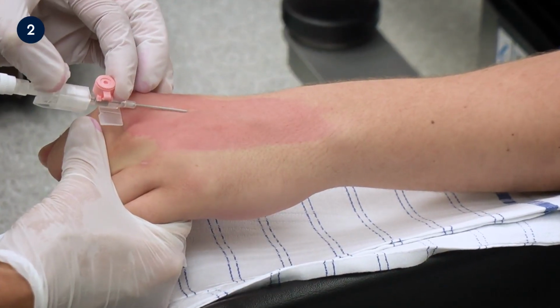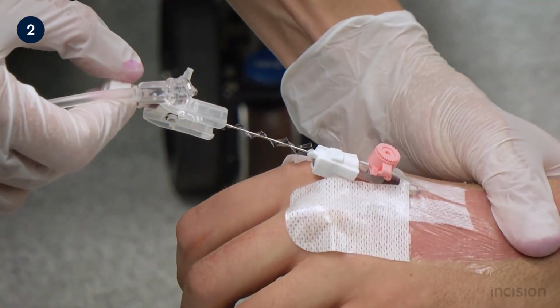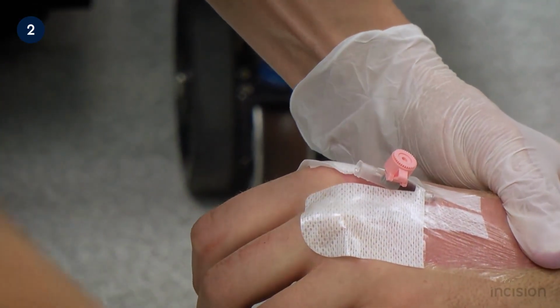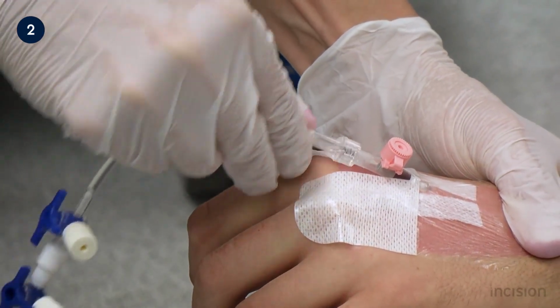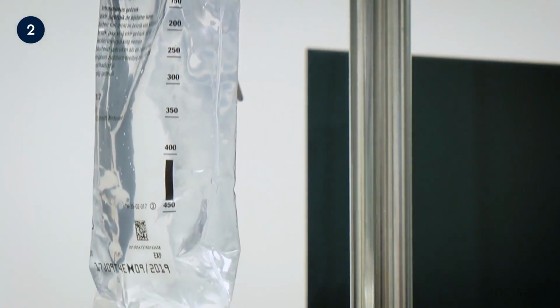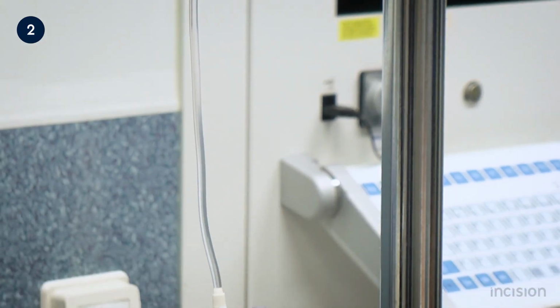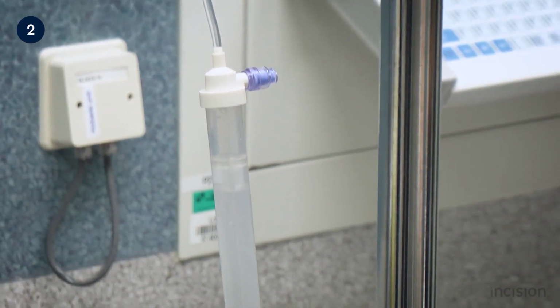Because of the risk of hypotension, it is essential that good intravenous access be established before administering spinal anesthesia. As previously mentioned, vasoconstrictors may be used to treat hypotension. This is, however, done in conjunction with fluid boluses. A fluid bag should be attached before commencing with the spinal anesthetic.